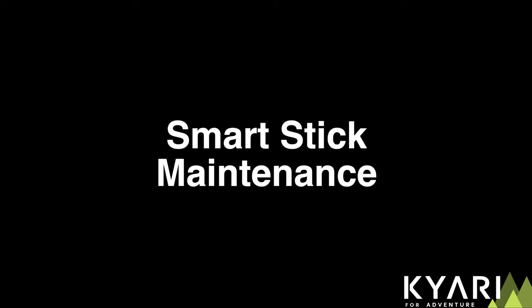Hello and welcome to yet another tutorial. In this video, we'll learn how to maintain your smart stick. We take our smart stick with us on all sorts of adventures, thus exposing it to dust and water regularly.